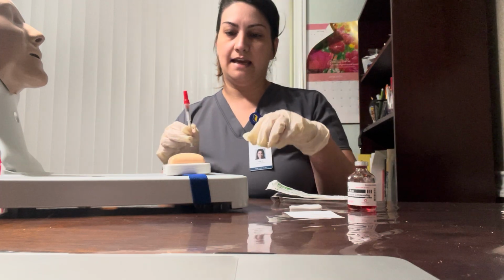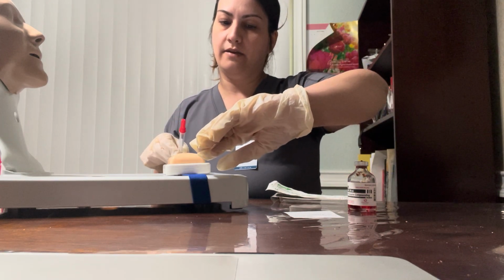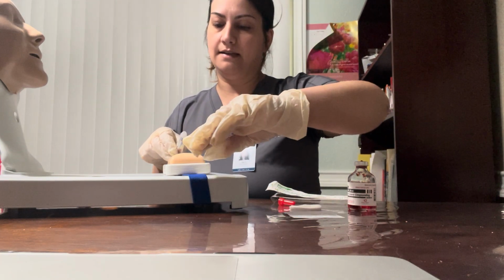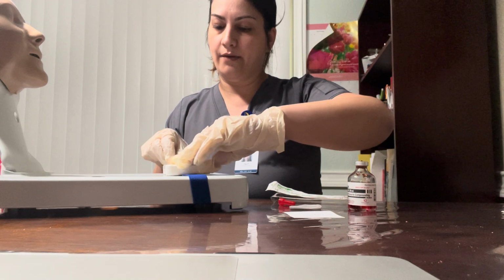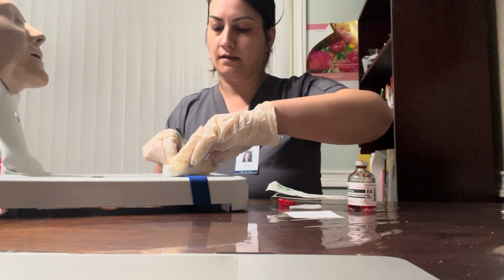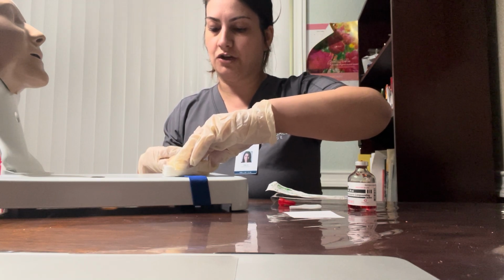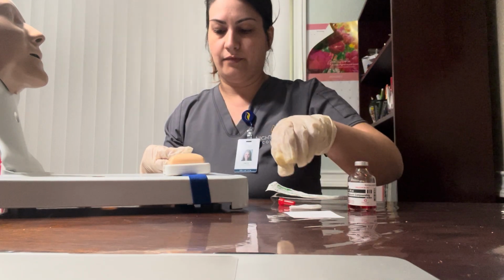So I'm going to take my non-dominant hand, and with my 2 fingers and my thumb, I'm going to pull down on the skin, take off the needle cap, pull down on the skin, at 5 to 15 degree angle. I will go in 3 millimeters deep inside the skin. Here's the poke. And slowly I will inject the medication, and I'm starting to see a mosquito bite. It is about 6 to 10 millimeters. I am going to release.